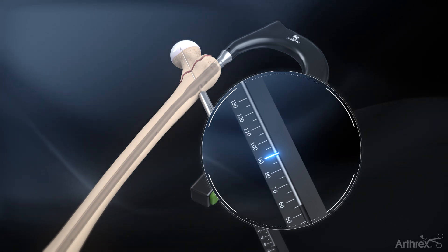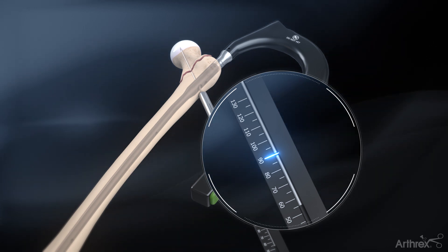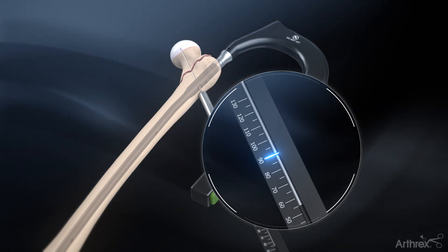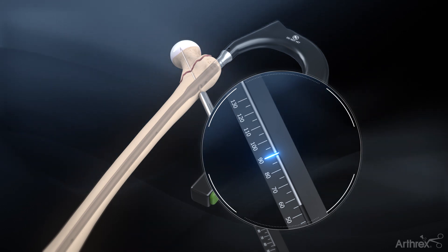The guide pin is measured to the tip, so at least 5 to 10 mm should be subtracted from the measurement when determining drilling depth and lag screw length selection. Other factors, such as fracture reduction, nail position, and anticipated fracture compression should be accounted for.